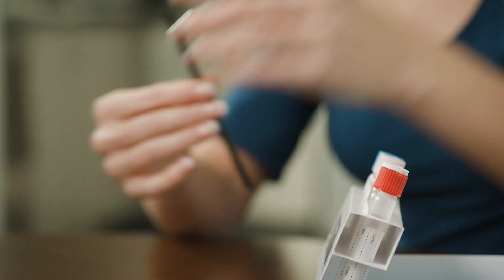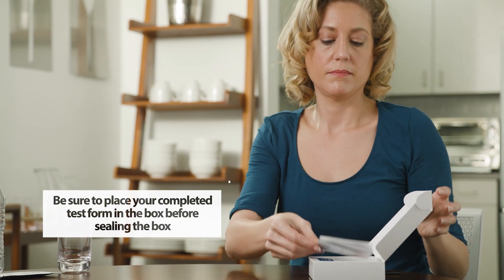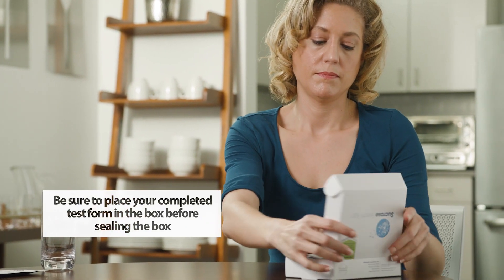Once you have finished breathing into the final tube, you may resume a normal diet and activities. Place all tubes back into their slots along with a completed test form. You do not need to fill out the test tube labels.